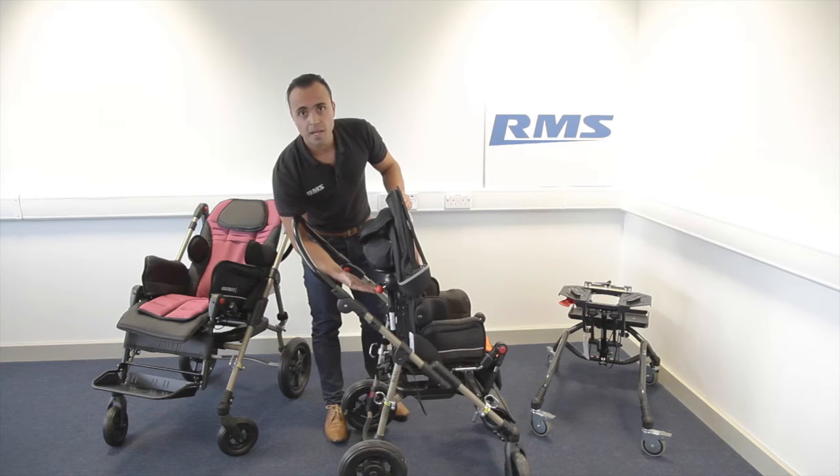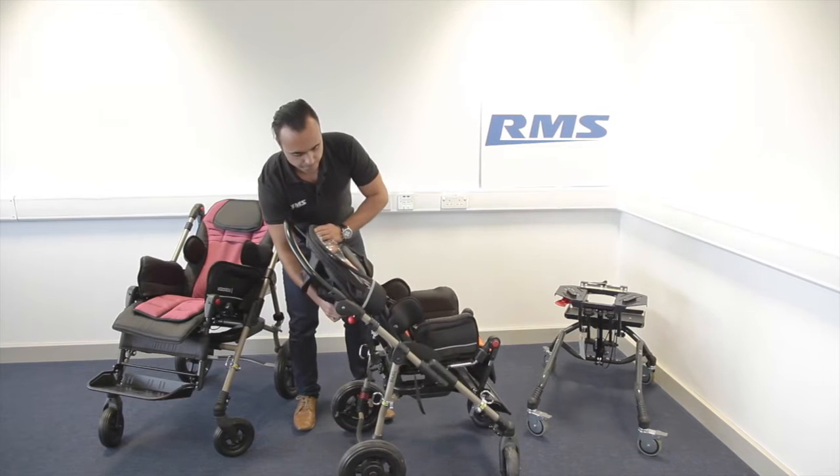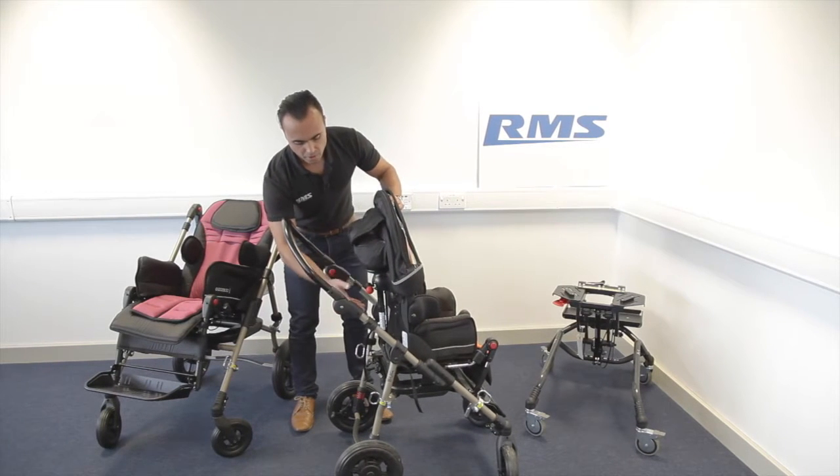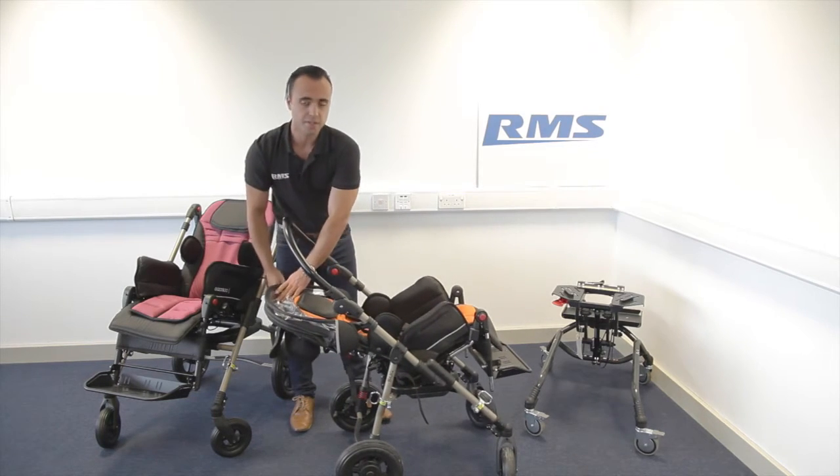The black button is for the recline, so you have 40 degrees of recline. Or you can do both and achieve this combined position.